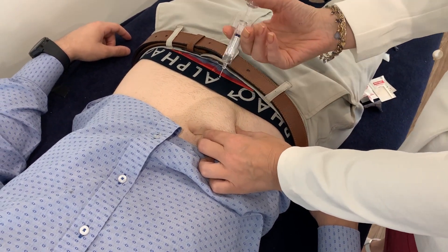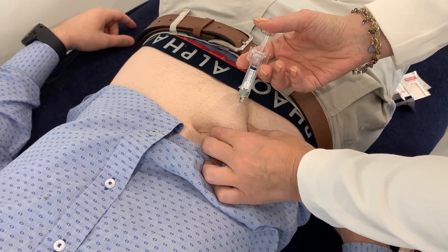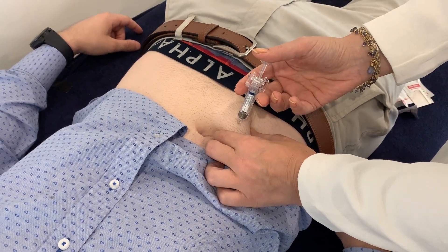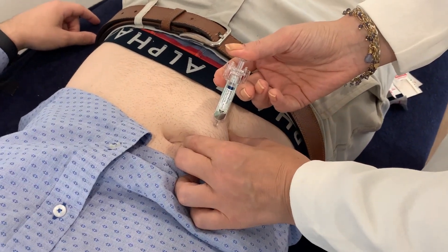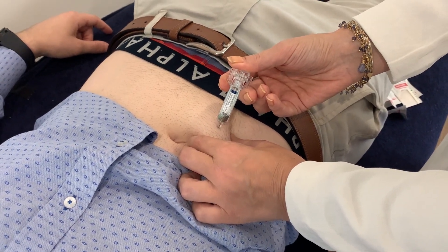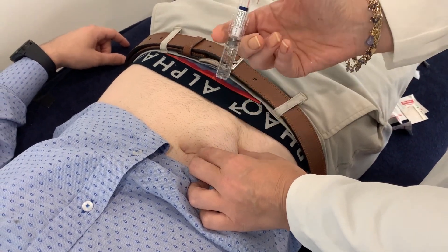You hold the needle like this and get it at a 45 to 90 degree angle to the skin, whichever way works for you. Are you ready? Push it in very firmly to the hilt. Once it's in, you then push the plunger down slowly, feeling how quickly your body wants to let the fluid go in. Push it to the hilt, you'll hear a click, and the needle retracts like that.